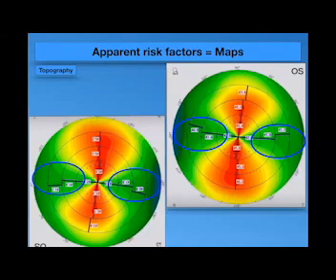Again, if the inferior point is more than the superior point by less than or equal to 1.5, it could be accepted, especially if there are no other signs in the coming maps and the coming slides. If you just have this, it's accepted to get a difference between the superior and the inferior points of 1.5 or less. If more, you have to suspect.